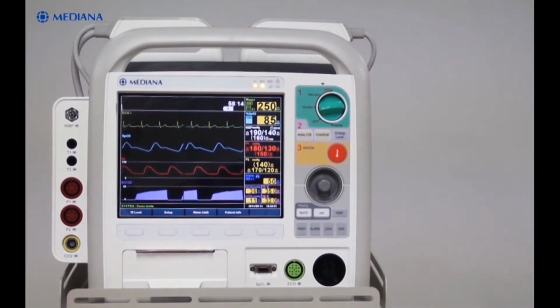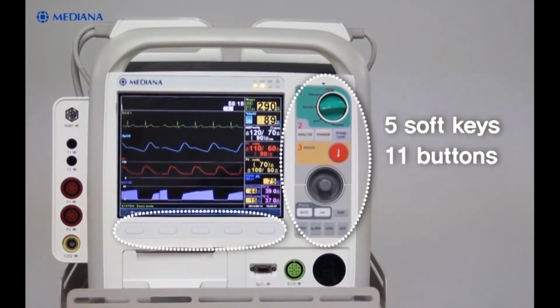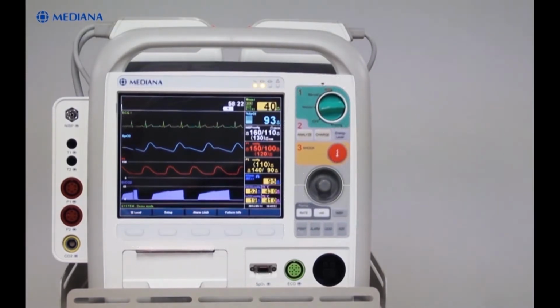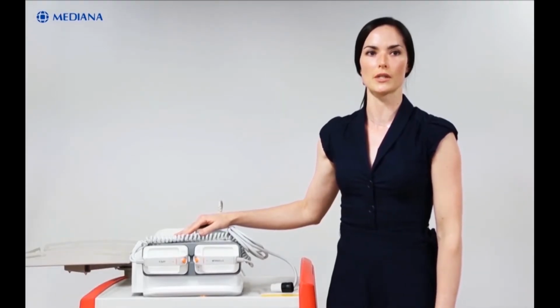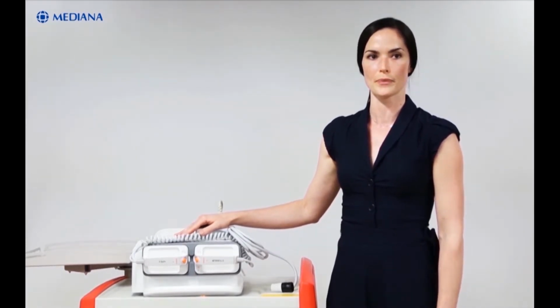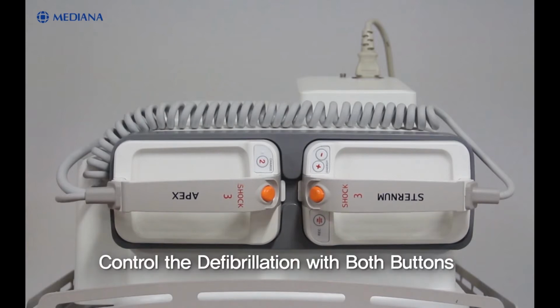Looking on the front, you can see here the 5 soft keys, 11 buttons, and 2 knobs, used for its simple operation. For the details of each button and its function, we will review it soon when I talk about its operation. To see the top panel components, you mainly see the paddles that deliver the shock and the buttons on them. One of the main advantages is that you can control the defibrillation with both buttons on the paddle as well as with the buttons on the unit.